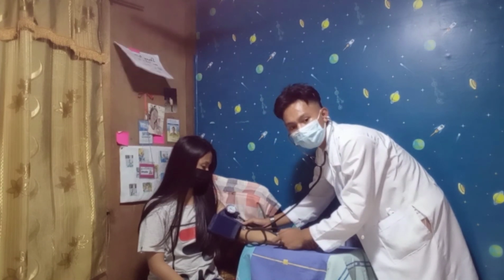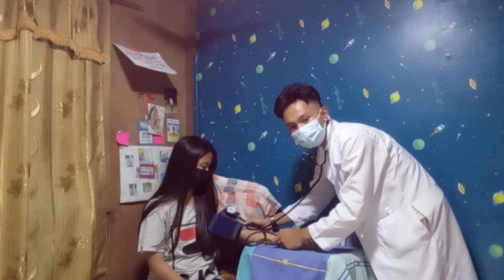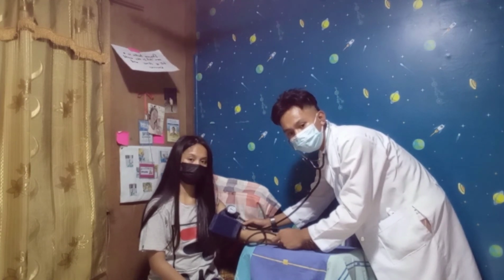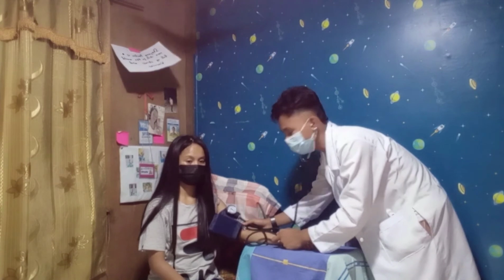Slowly release and open the pressure valve and watch the manometer gauge fall at a rate of 2 to 3 mmHg per second.